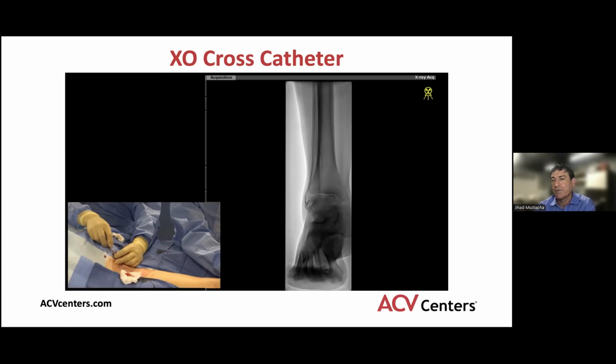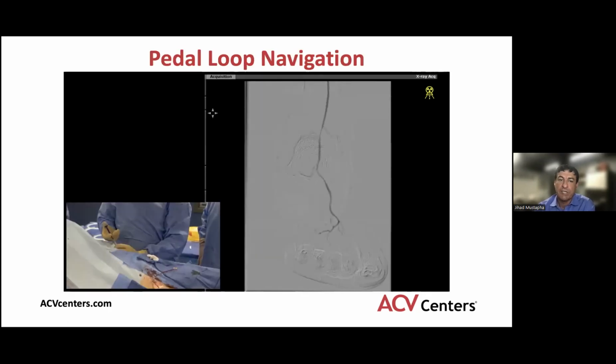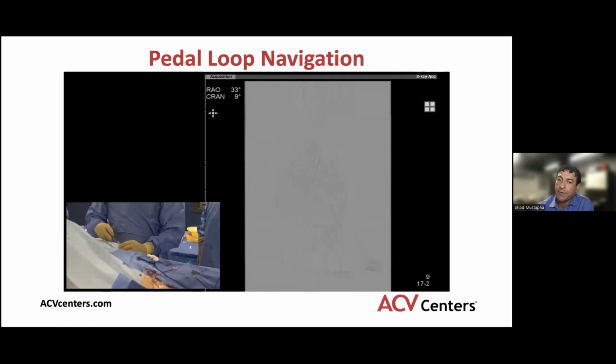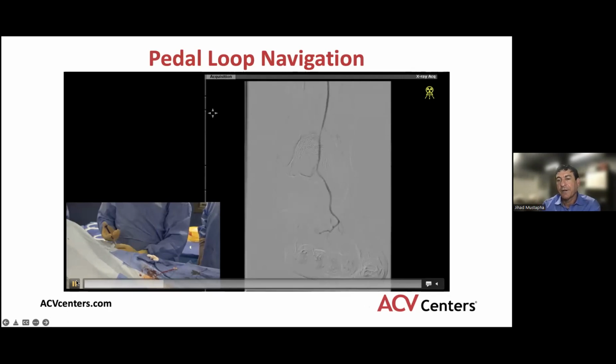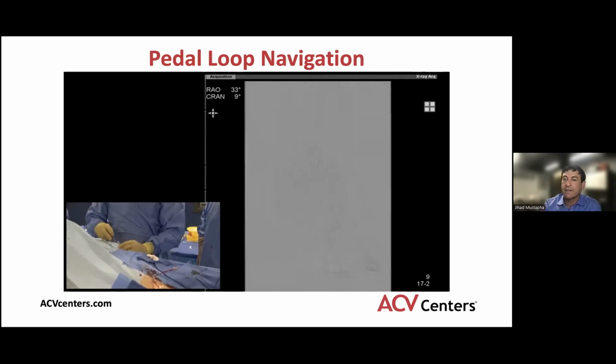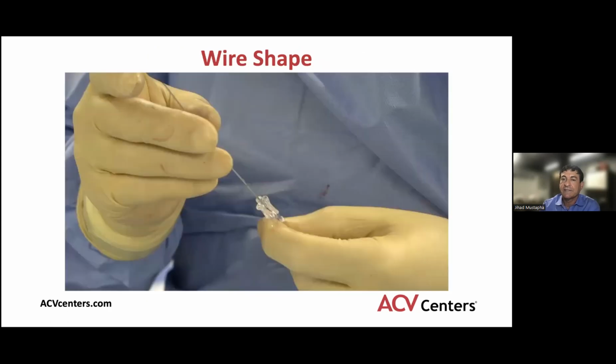So the Exocross catheter was very helpful in this scenario. It helped us do the selective angiograms that showed us an intact dorsalis pedis, as well as the arterial arch and digital branches, and comparative flow from the ipsilateral AT injection. So keep in mind, the catheter here gave us comfort that the arterial arch and digital branches are intact. Another decision is, do we just go ahead and treat the inflow, which will give us this kind of result at the end, or do we treat anything further?